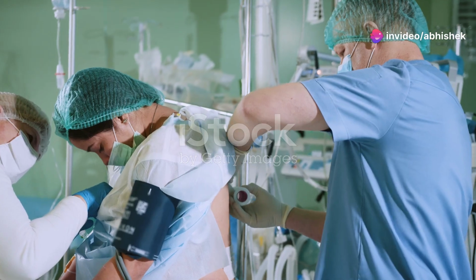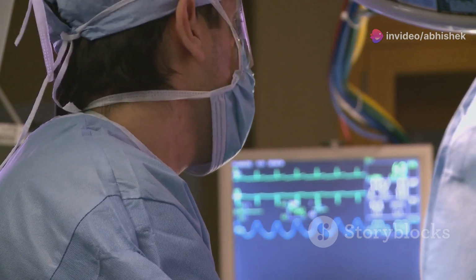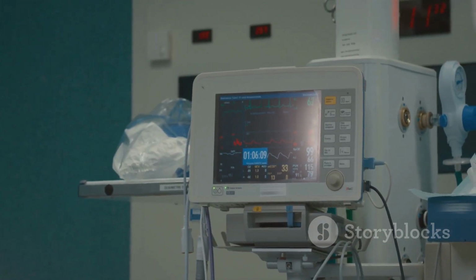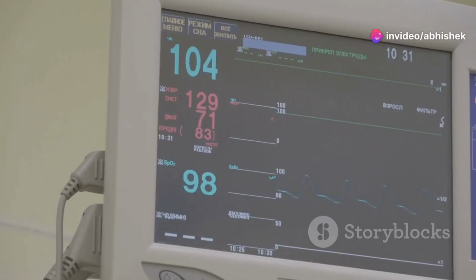Now, we can't just put someone to sleep and hope for the best, right? We need to keep a close eye on them throughout the entire surgery. That's where monitoring devices come into play. These are like our eyes and ears inside the patient's body, giving us real-time information about their vital signs.